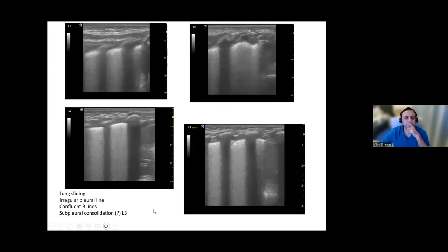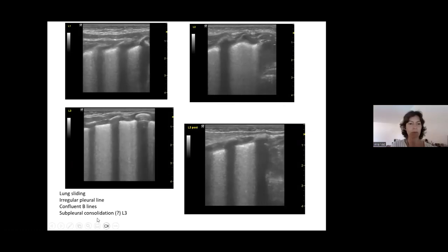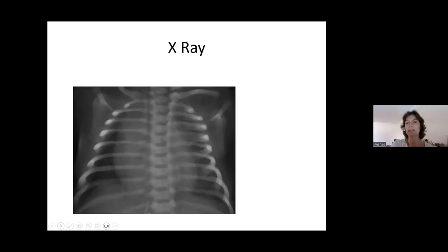The baby was supine. So the X-ray was not typical of meconium aspiration. Completely agree. So I was in doubt if you could classify the ultrasound like that or not. It's the first ultrasound. What's the age of the baby? It was after admission in the NICU in the first 2 hours.